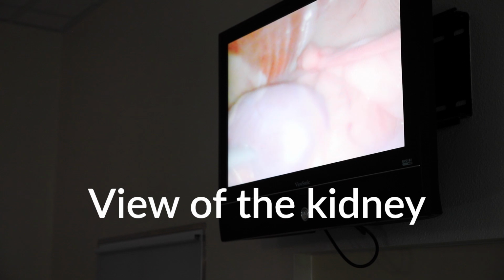And as you can see in our video, we have a lot of visualization. We do a tour of the whole abdominal cavity. We look at the gallbladder, the liver, the kidneys, the bladder, the ovaries, the pancreas, the intestines, the spleen. And we have had many cases, or a few cases rather, where we've identified disease in the patients, such as no kidney, or just having 1 kidney instead of 2, or a polycystic kidney disease type of thing. So we've been able to identify those diseases with the laparoscopic technique, whereas the blood work suggested all was normal, and the patient suggested that they were normal as well.